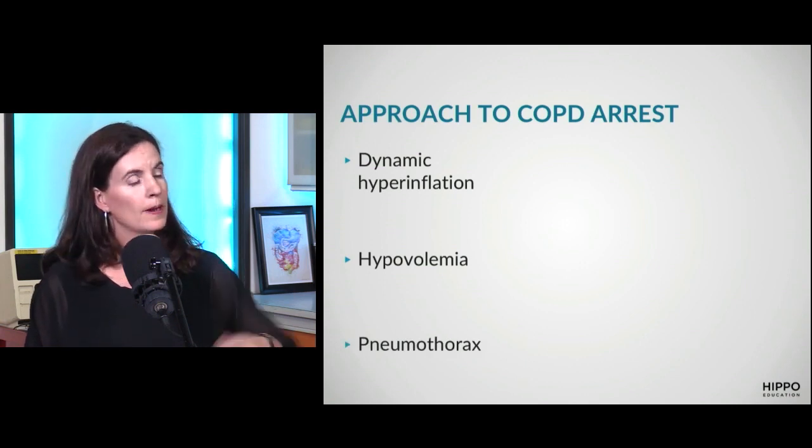Sarah, on the last slide, you put respiratory rate is too fast. Is that because it's going so fast that they don't have, again, that chance for full expiration? Exactly. Okay. And what I mean by that is that the setting of the respiratory rate on the ventilator is too fast for them. Because at this stage, they're not breathing on their own. You want to slow that vent respiratory rate down so they have all the time they need to exhale. Okay.